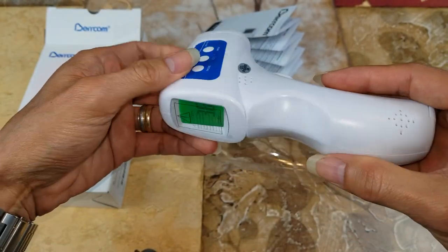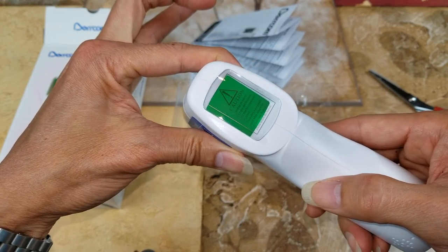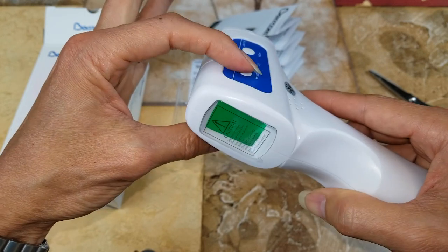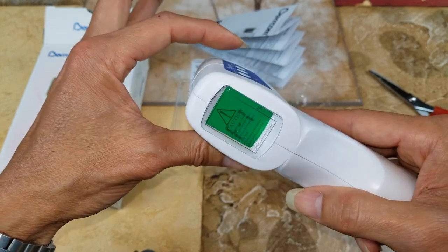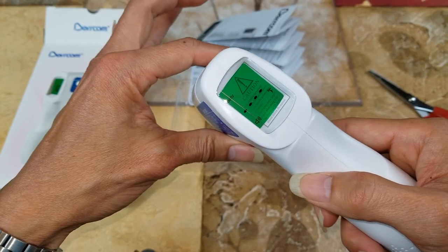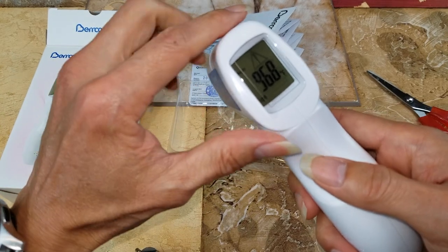I wonder how to change to Fahrenheit. Oh there you go — you press and hold down the mode button. This shows F1. Now it's in Fahrenheit — wow, 96.8 degrees. I guess that's fine.